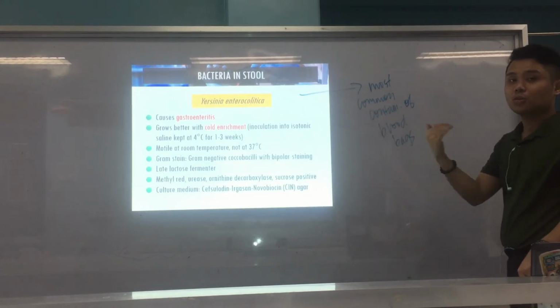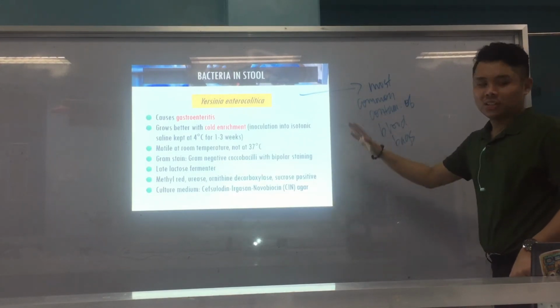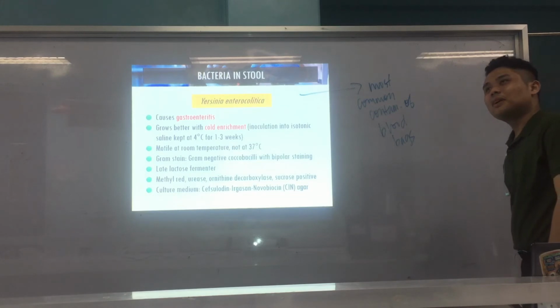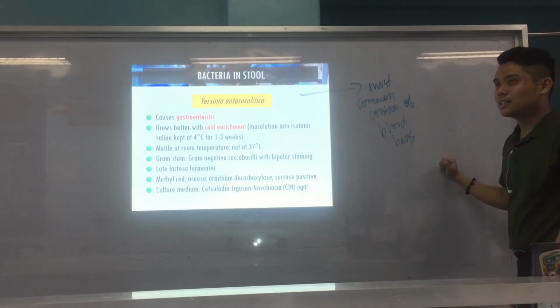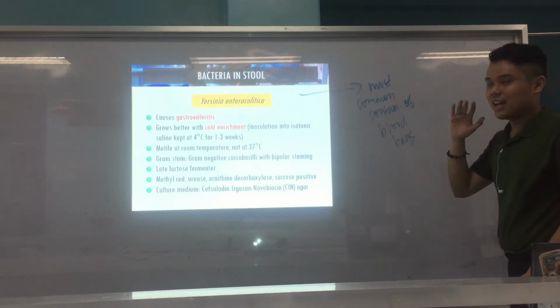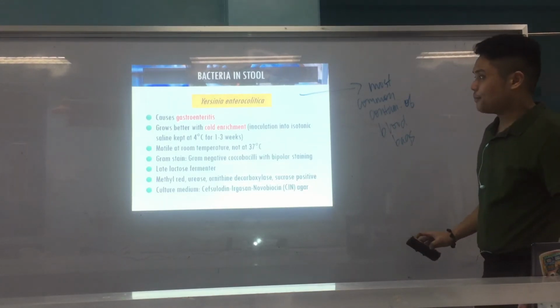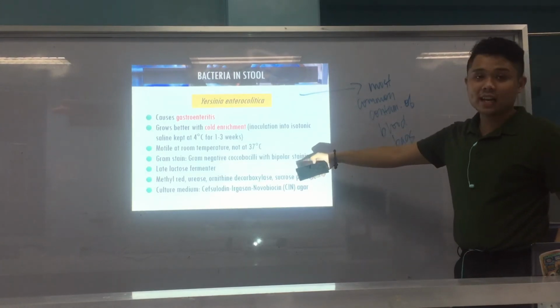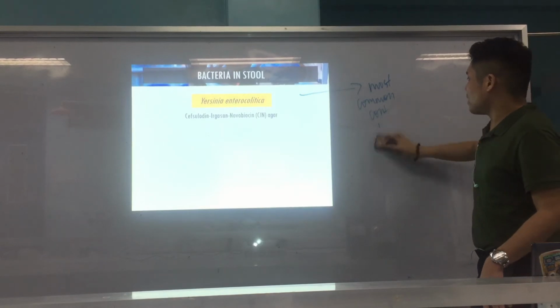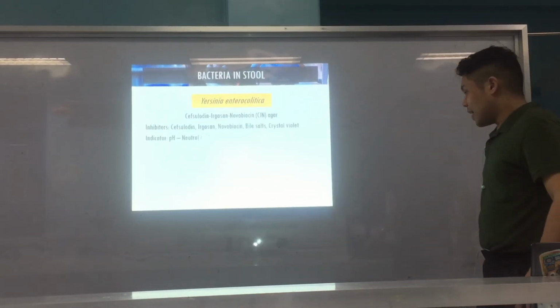Because your blood bags are stored at ref temperature. So, ganun siya 4 degrees Celsius man. So, siya ang considered to be the most common blood contaminant. Tama ba? Most common contaminant of blood bags. If ako nasayop, guys, ha? Basta na-mix na ako siya, nasayop na akong memory. Anyway, alright, ayan. That's for Yersinia enterocolitica. Okay, alright. And bipolar staining under gram stain. Okay, alright. Again, we have its culture medium of choice, your cefsulodin, irgasan, novobiocin agar.